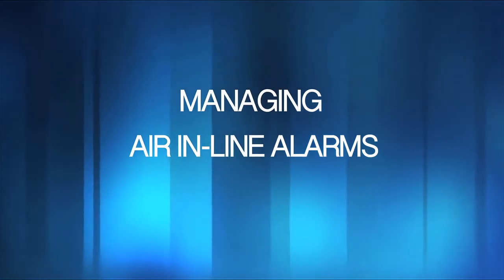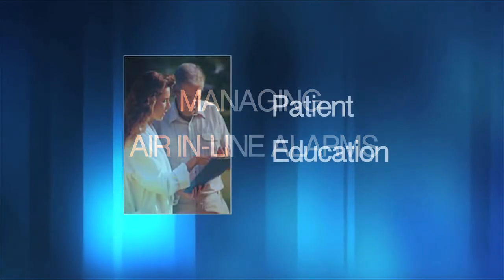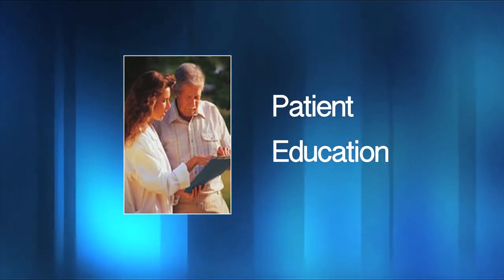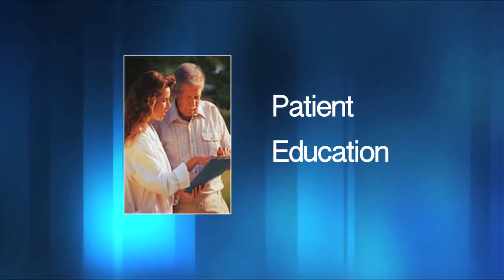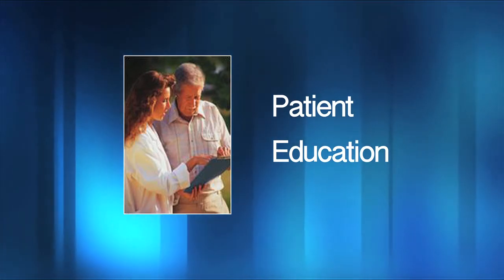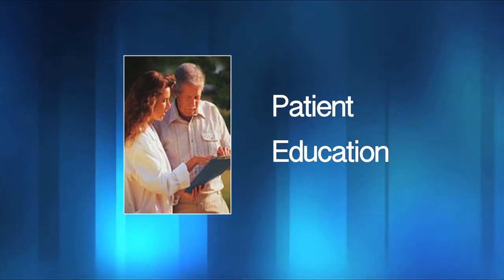You and your patient need to have a plan for managing air in line alarms. Teach your patient how he or she should manage an air alarm. If they are unable to prime the pump, ensure they know how to silence the alarm and call the nurse to discuss how to manage the alarm. They should be aware that if they turn the pump off, this could create further complications such as catheter occlusions or missed doses of prescribed therapy.